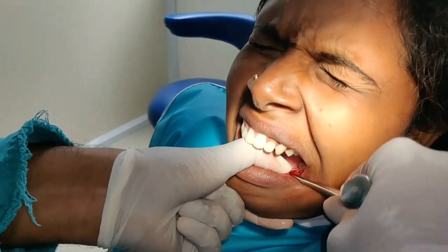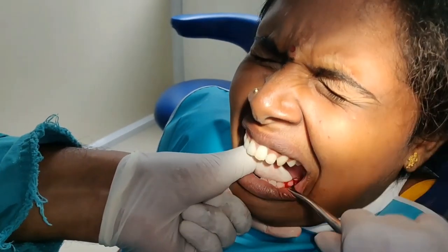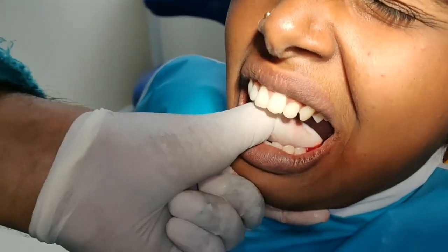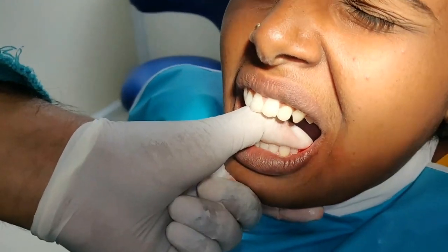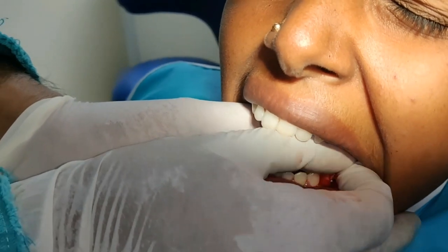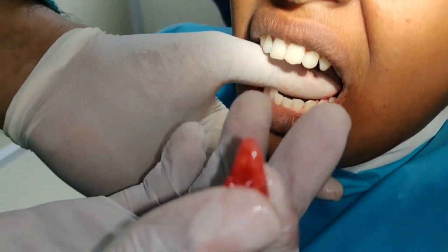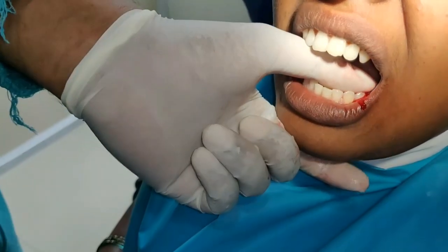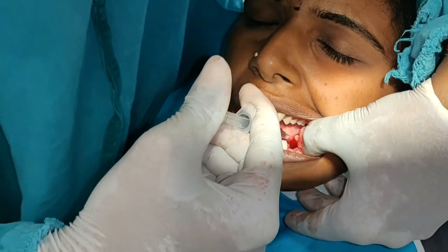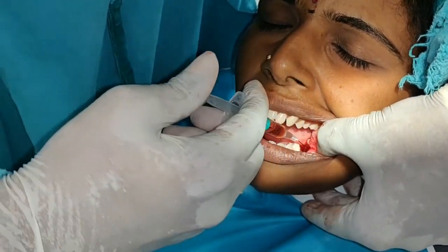As I am applying this technique, the other root also pops out of the socket. So now we have successfully removed both roots from the socket. Before packing, let me disinfect the socket by using a betadine solution along with saline.